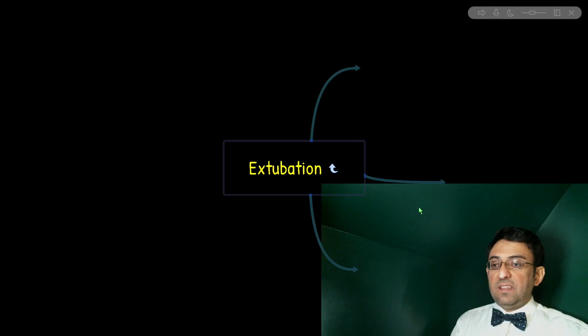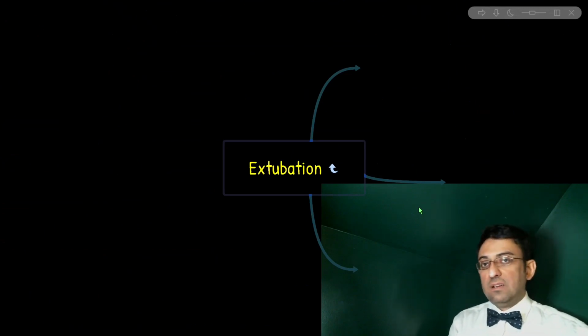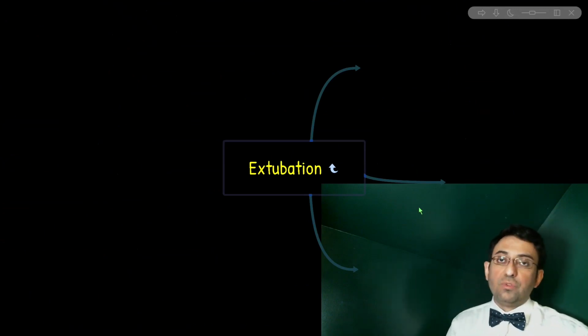Define SBT. During a spontaneous breathing trial, the patient is still connected to the ventilator, but the ventilator support is turned off and the patient is allowed to breathe on his own. The time is usually 1 to 2 hours. This is usually accompanied by what's referred to as sedation holiday. That's we either don't sedate the patient during the trials or we just provide half the regular dose of sedatives.